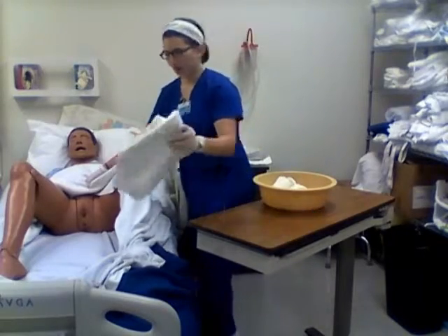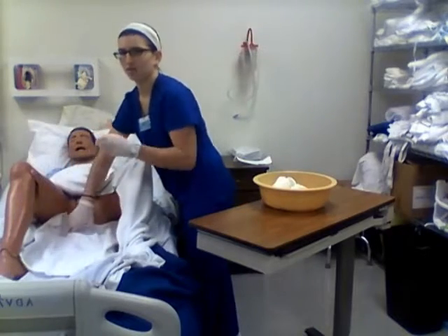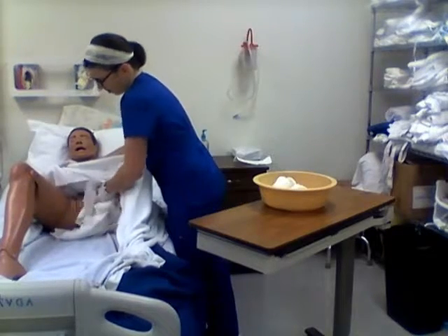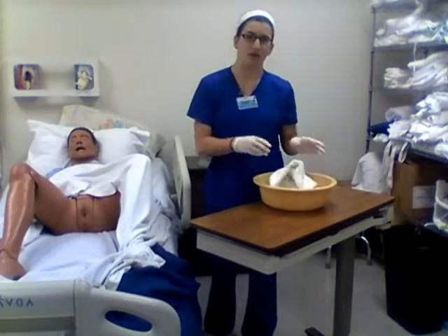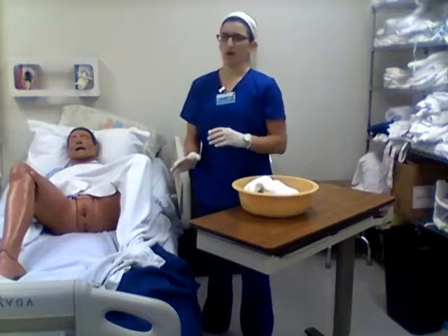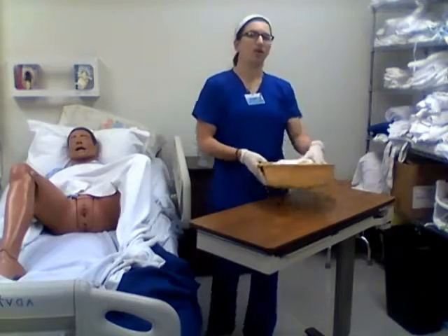All right, so now we can pat her dry, and I would have had a towel laid down prior, that way we don't have to change our bed sheets again while we're doing this. So now we can pat her dry. And that's going to help prevent any infection that could possibly happen, because it's a pretty common thing with getting in a catheter. So now we're done with the pericare, so we can throw away our laundry.